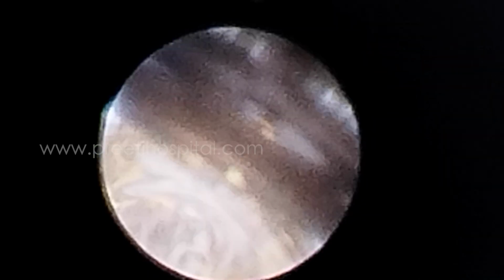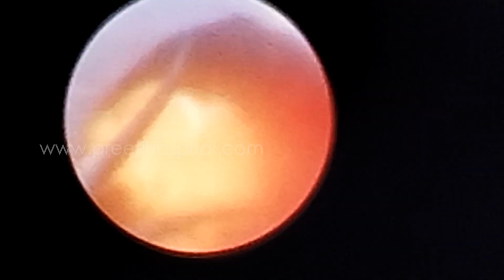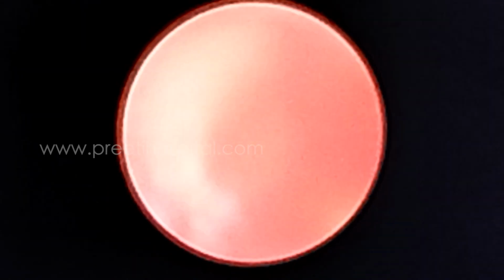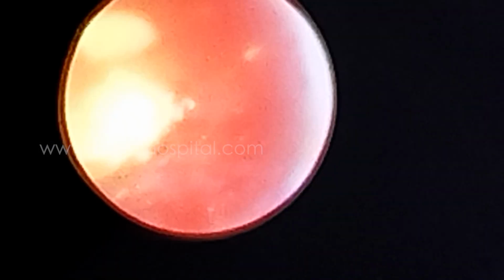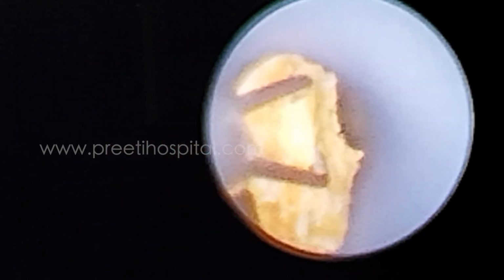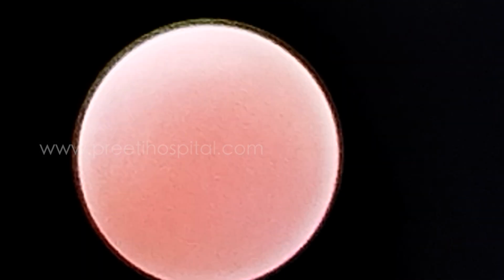Something is the problem with all the forceps. This forceps is not functioning. They should be regularly changed because these are all low cost. They will... flush. See how much this forceps is troubling. You should not lose patience. See, this forceps is better. Okay? All you need is patience.